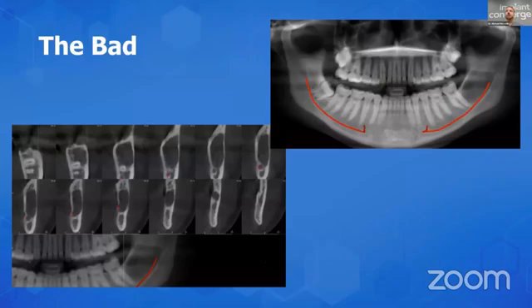All right, so I went pretty fast through that presentation, so I just added a few extra slides here. Just really interesting finds. This has nothing to do with TMJ, but really, this is very, very common. You'd be surprised. It'd be like an endodontist finding a third canal, because you have to imagine he's getting a lot of referrals, and it's the same thing with what I'm finding. I get a lot of referrals where there is already an issue, and so what is it? Saving the patient potentially less time in the chair, not having to go to an oral maxillofacial surgeon, and really getting a good idea of what the next steps are when you have a finding like this.